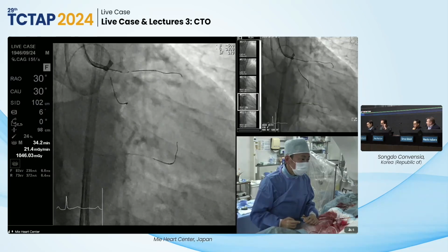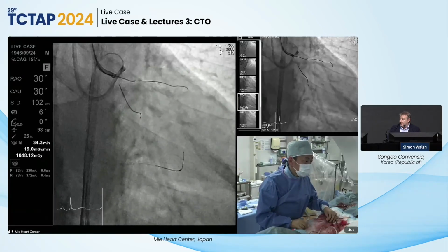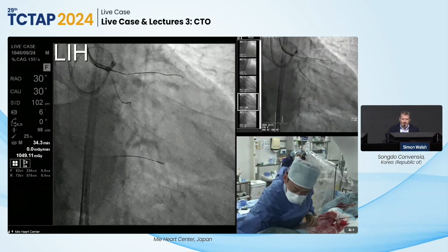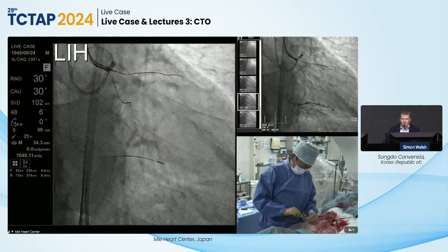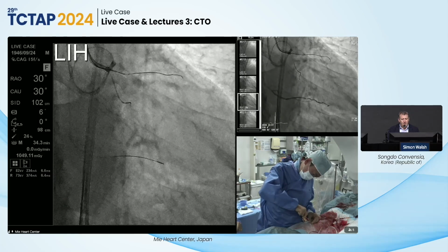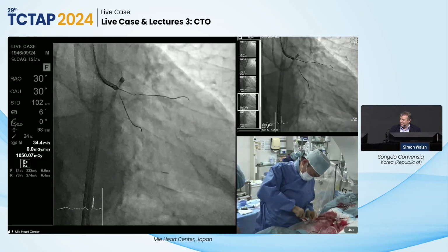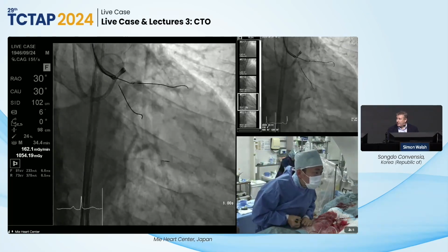I think it's an important conversation to have, and you know, there are a few options now, which is useful, and the expense between them is different. The EGG nest, I think, is an interesting one. It actually goes holistically around the whole room, and it's about a 95% reduction in scatter, it's impressive, with the entire room involved. There's Protego, there's various other things. So I think we need to collectively start pushing our organizations and hospitals and societies into taking the issue of radiation protection pretty seriously. Yeah.